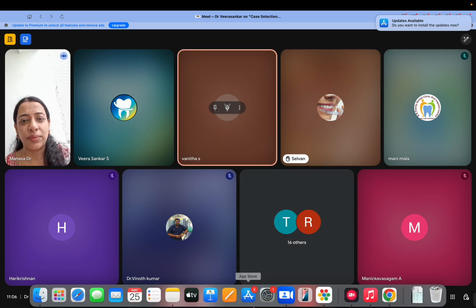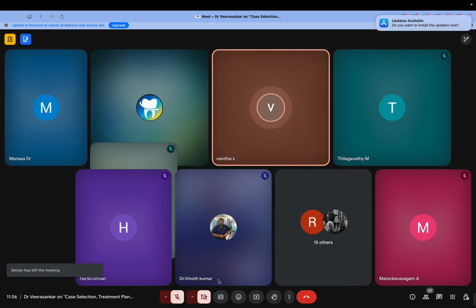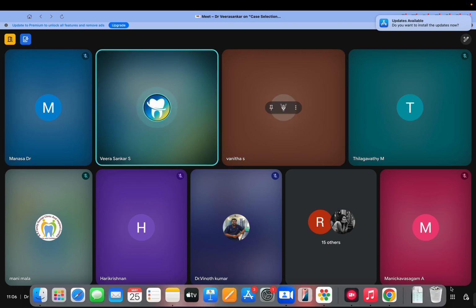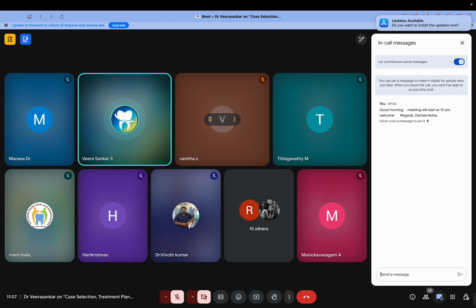Hello. Yes, doctor, you can ask. Doctor, just a small doubt. Is it that only in the attachment region we have force, or do we have force all over the aligner, and in the attachment we have excess force, doctor? Yes, sir. We have force all over the aligners. In the attachment region, either we exert excess support, or sometimes we can apply force through the attachments.